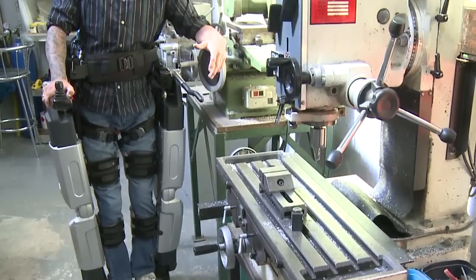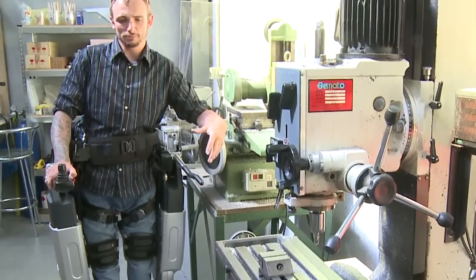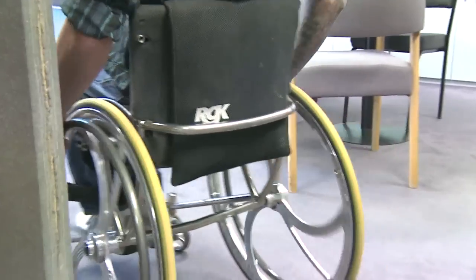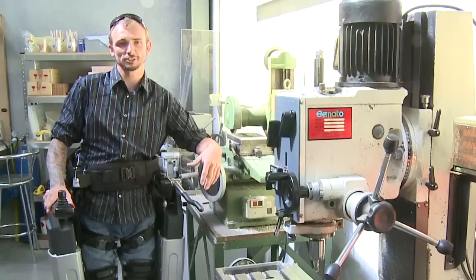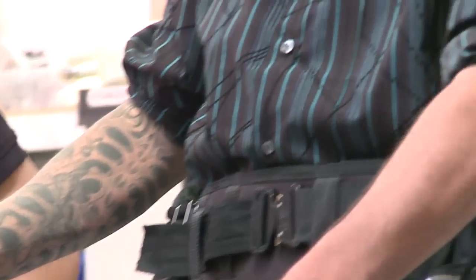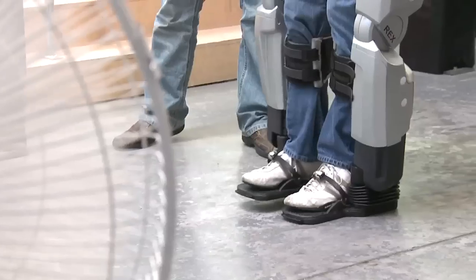I've found a lot of benefits from Rex personally with my bladder. When you're sitting in a wheelchair your body doesn't move around so much, so the fluid inside isn't washing all the internal sides of the bladder and you're prone to getting infections. But now that I've had time on the Rex I don't seem to be getting those complications anymore, which has been a real big bonus for me.